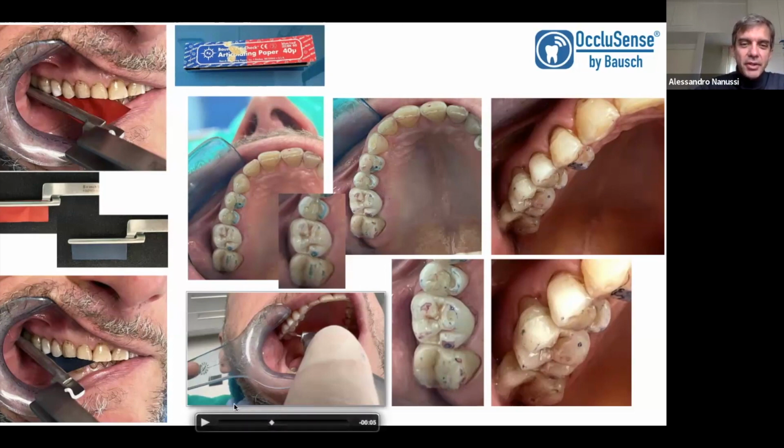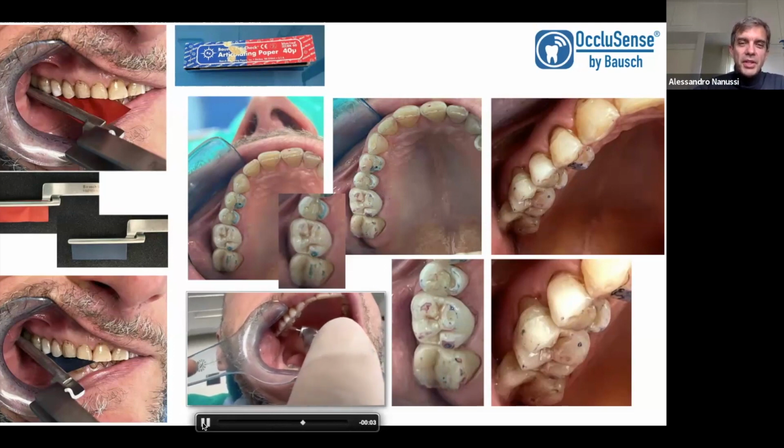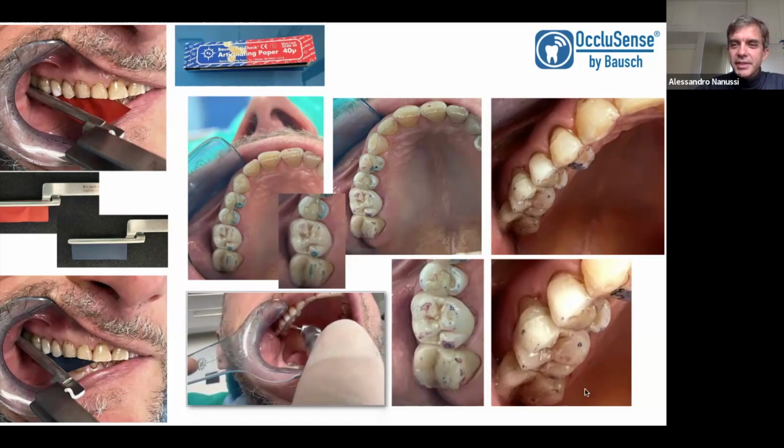I immediately go, you can see here, with the bur, slowly, and avoid those contacts. Then you can see the final check with points of contact in blue and no interference, no precocity in lateral movement.